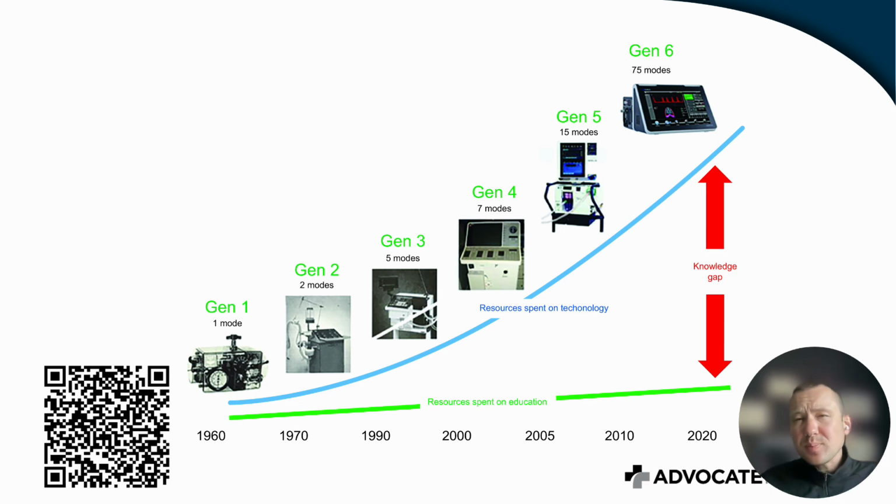For example, just by clicking a small button called automatic tube compensation on volume control, you can transform the breath into a pressure controlled breath, but the name of the mode still does not change. So you can have misleading information about what the mode is doing for your patient at any given time.